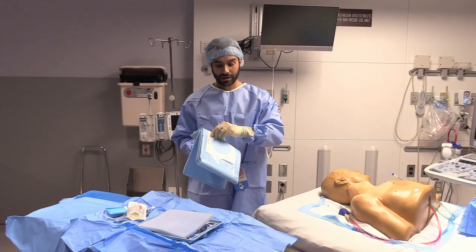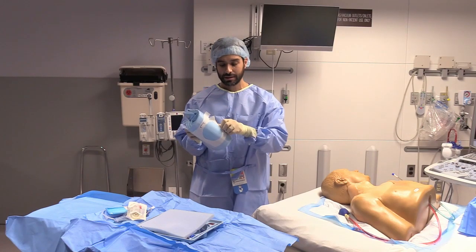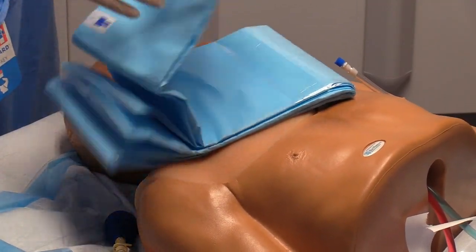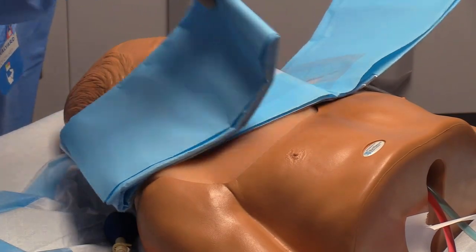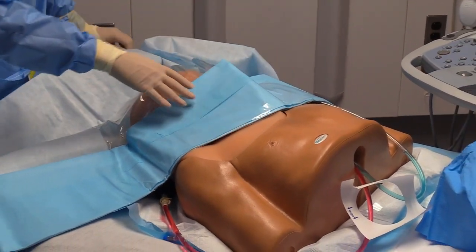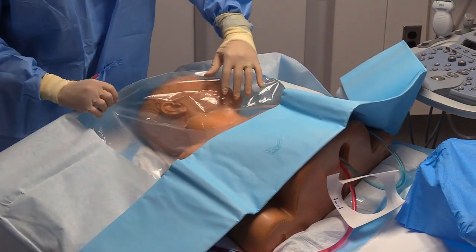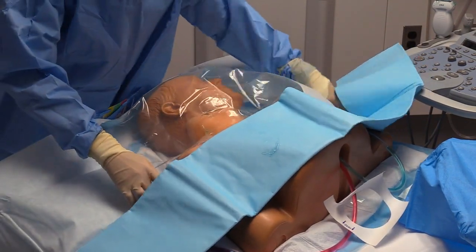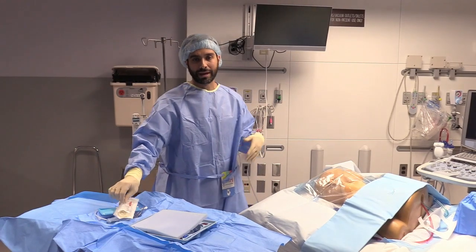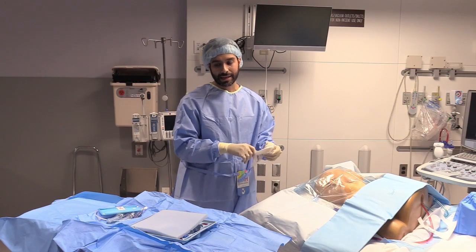And then we're going to take our drape and look at where the physician says head, obviously towards the top of the patient's head. We're going to pull the sticky tags off and place over where we think we're going to be placing the catheter. And if you have a friend that's there, they can pull the distal end of the drape towards the patient's feet. In this situation, you just have this here and place the sticky portion over where you think the catheter is going to be placed. Invariably, at this point, something may have gotten into that area, or something that was unsterile may have draped up underneath there. If you have somebody there, pull that out of the way. Open up the ChloraPrep that comes with the kit and re-prep.